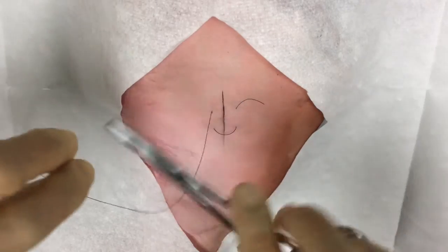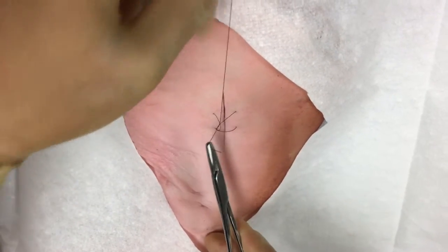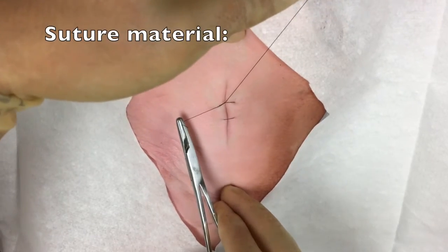The suture is then tied off in the typical fashion using either an instrument tie or a one-handed or two-handed surgeon's knot.